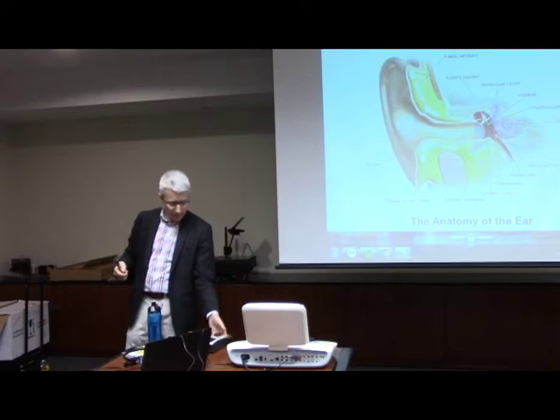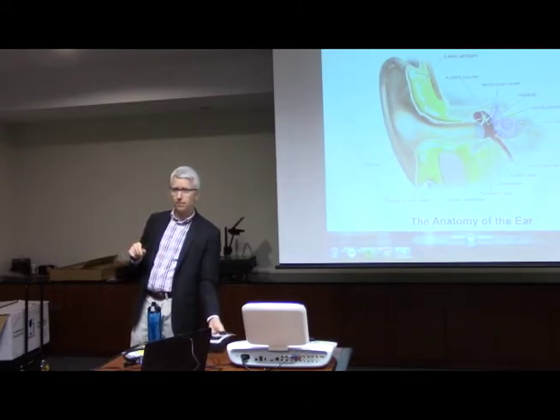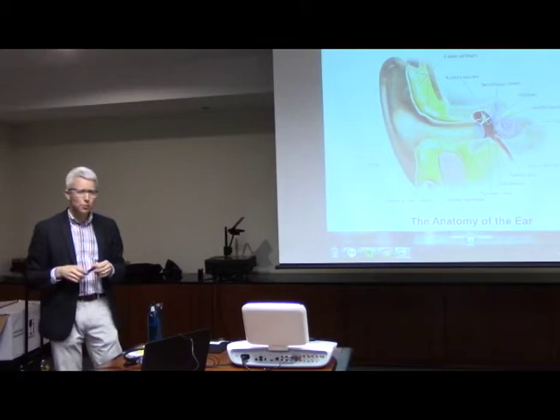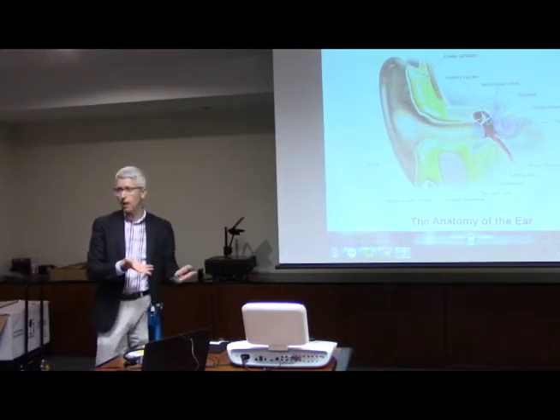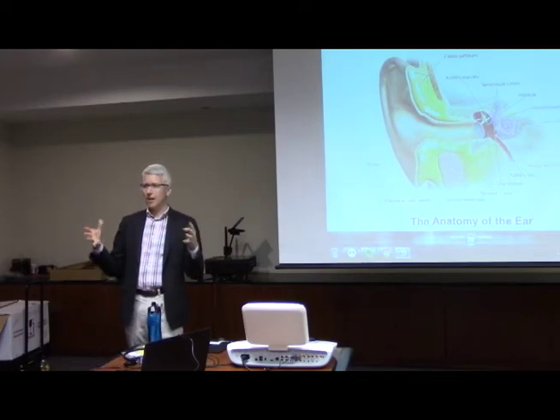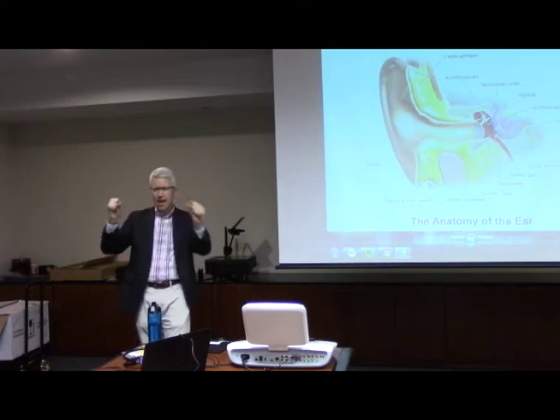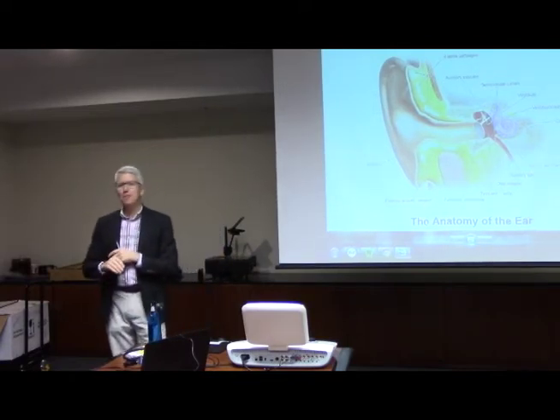Whereas something like this, you're looking at about $1,000. There are some really, really basic, lightweight, not the most durable that you can get for about $700. Those aren't usually the best, but it varies. You can spend up to $1,400, like an old, there were the MA41s and MA40s that were portables that were built like a freaking tank. I mean, these things had a thick case, and you could just throw it in the trunk of your car, and they would last forever.